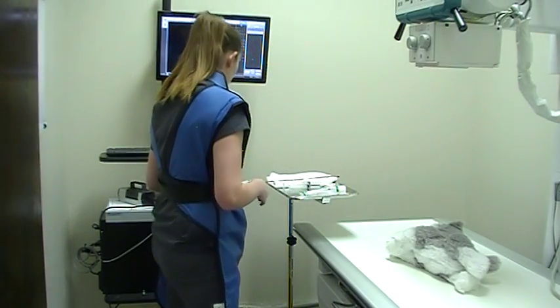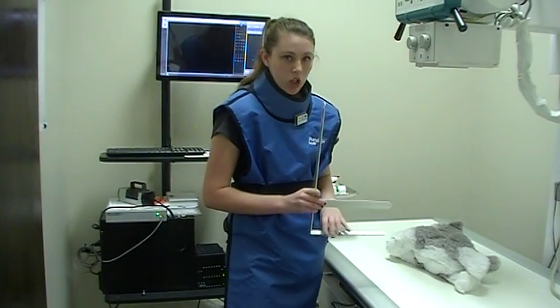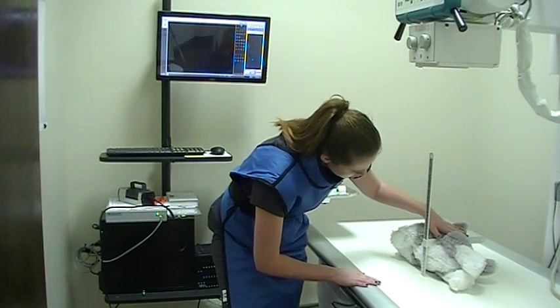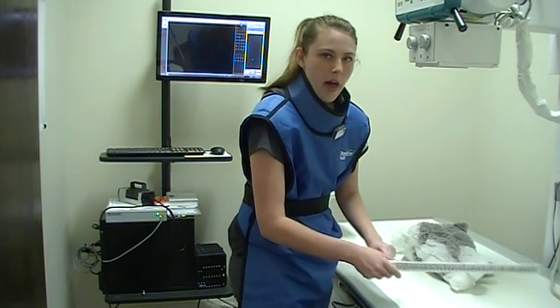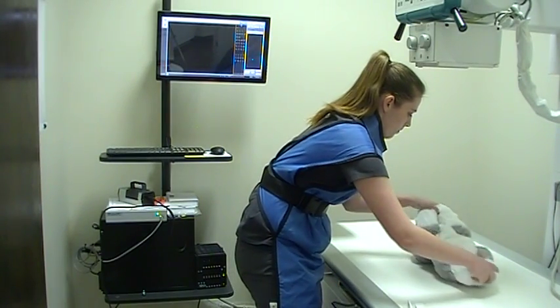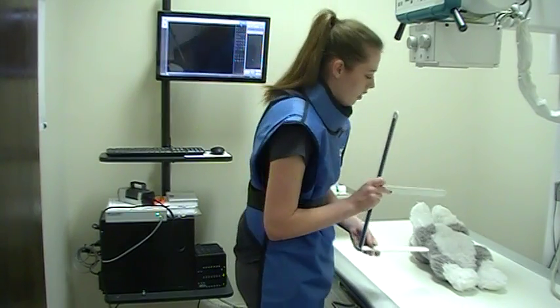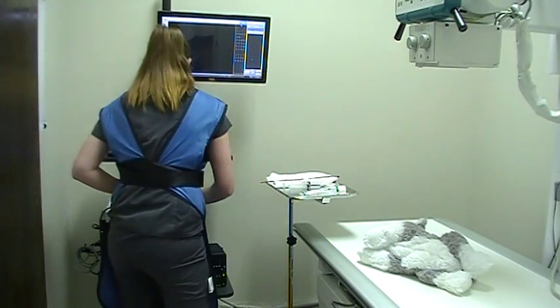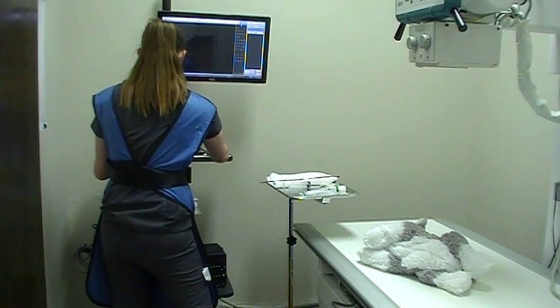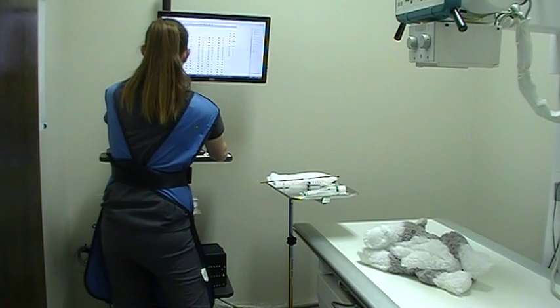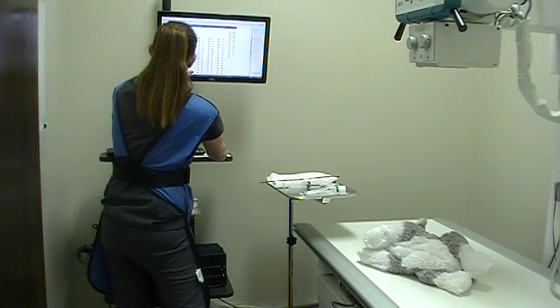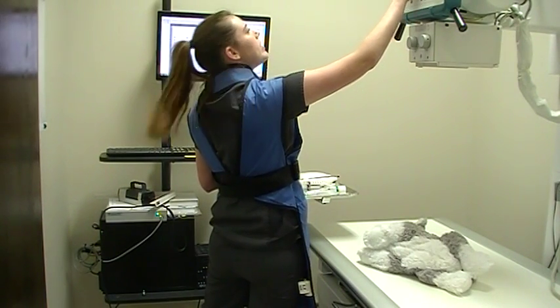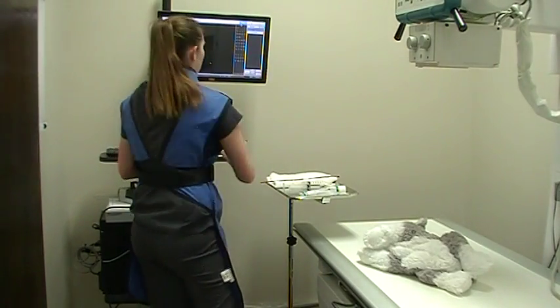So we want to measure our patient. We have our calipers and we want to measure at the TL junction, which is the biggest part of the abdomen. I got a measurement of 9. We also want to go ahead and measure our patient for the VD view as well, also at the TL junction. Our patient is a 9 on both sides. Looking at our technique chart for a 9 cm abdominal radiograph, we are going to set our mAs at 6.4 and our kVp at 60. Those will be our settings for both lateral and VD views.